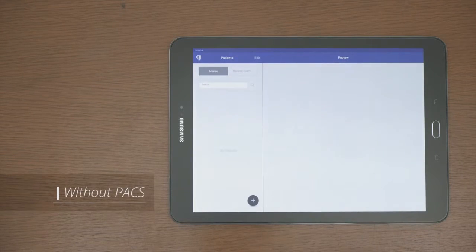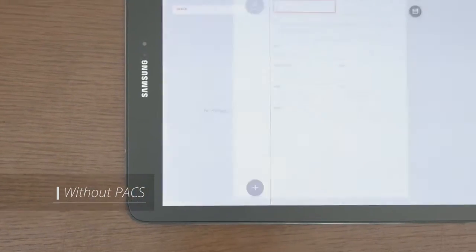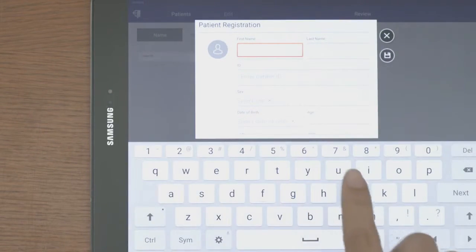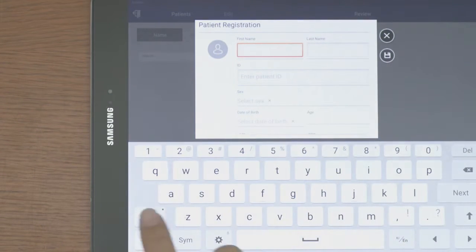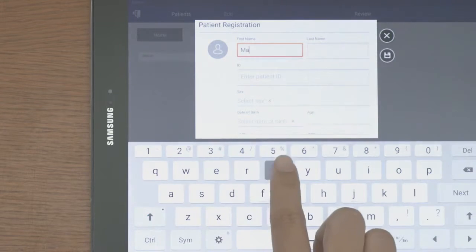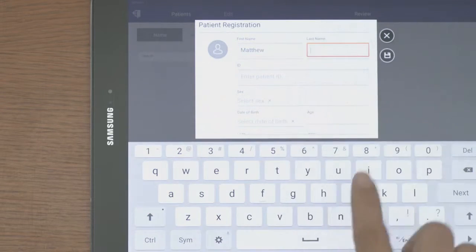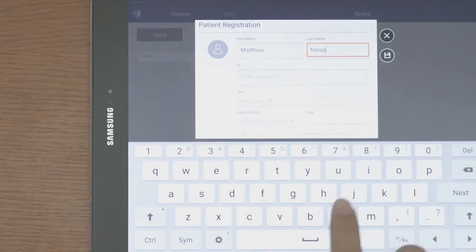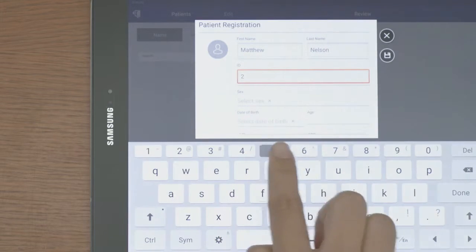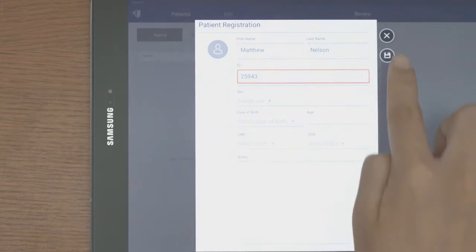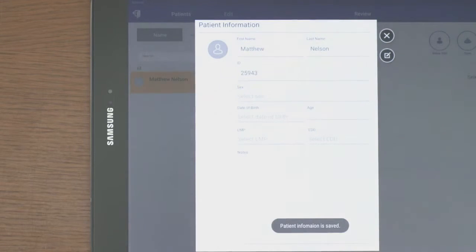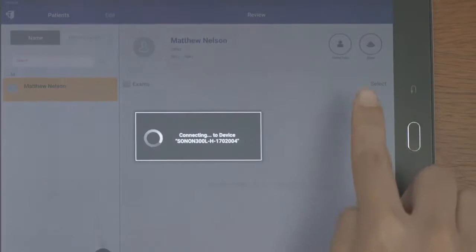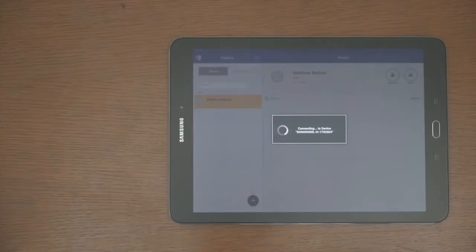When PACS is unavailable, go to Patient List. Tap the plus button to enter patient information. Patient name and ID is mandatory. Then, tap the scan button to start scanning for that patient.